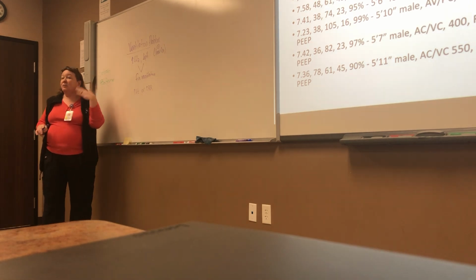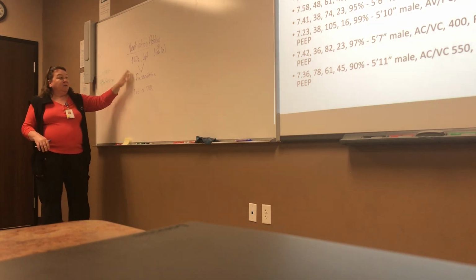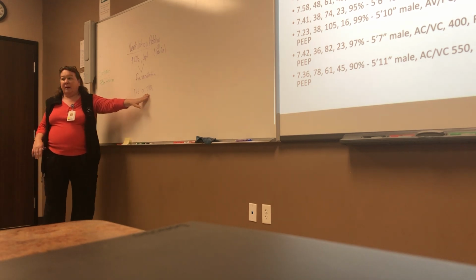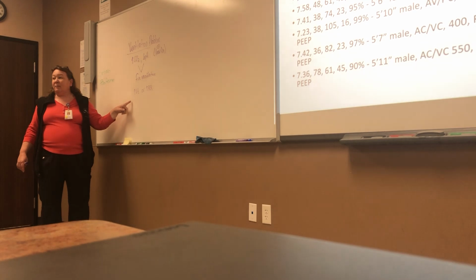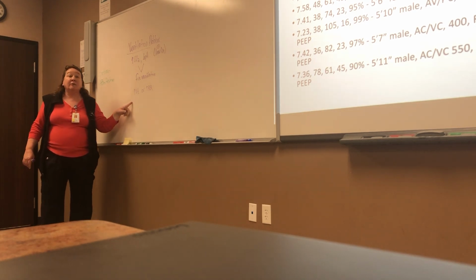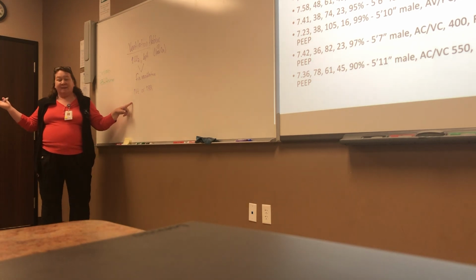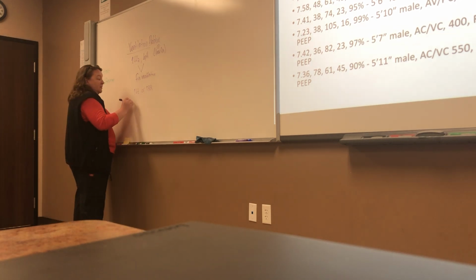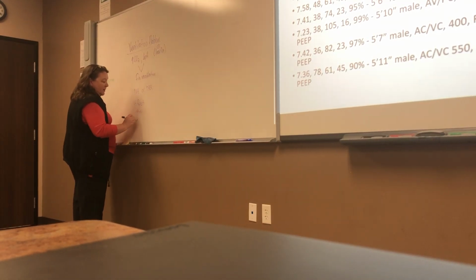For those of you who are struggling, we'll do more tutoring, more review, whatever you need, but you must get this down. So fix ventilation: tidal volume or rate. If your tidal volume can be changed and stay within your range of reason, if it's almost at the top, you're not going to change it by 10. So it's tidal volume first, then respiratory rate.